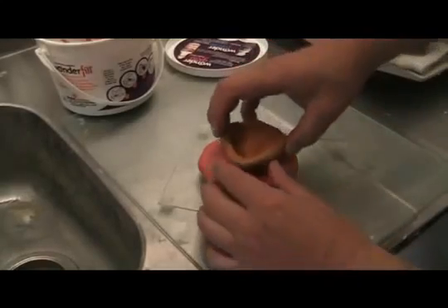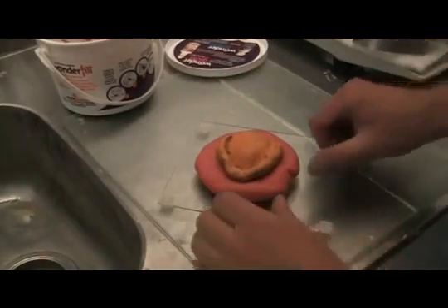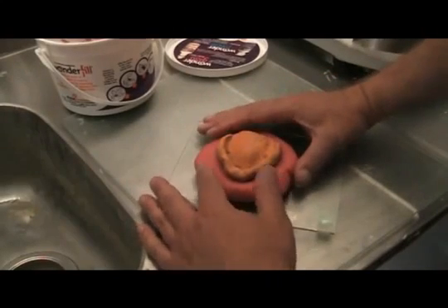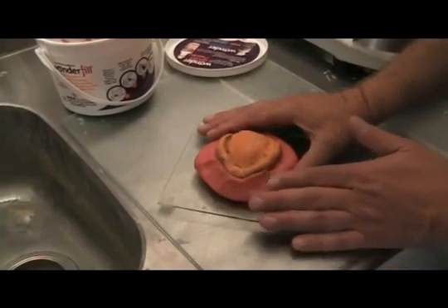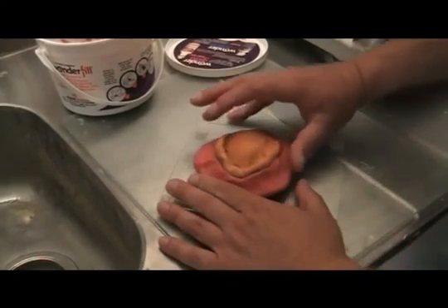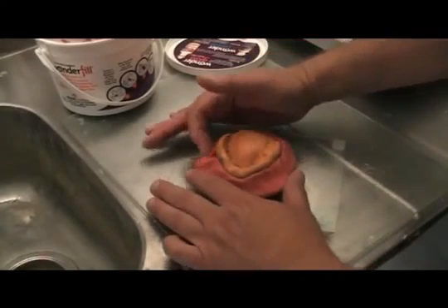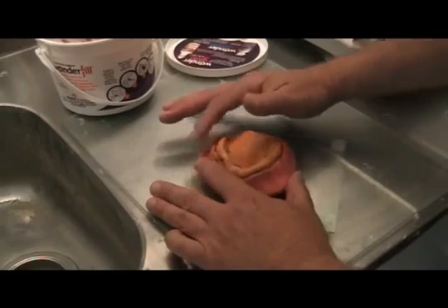So I'll take that and I'll press that into the material. You'll notice that it kind of pushes away. That's okay, it's not a problem. And what I do is I take my finger and just push the Wonderfill material up around and to that line that I drew on the impression, which indicates the depth of sulcus that I want.